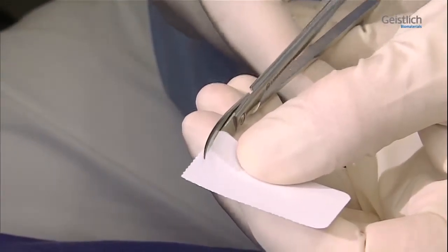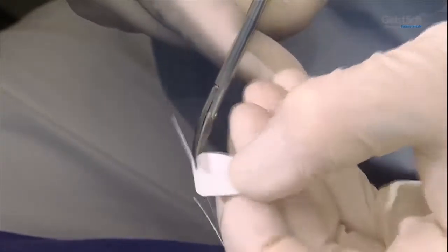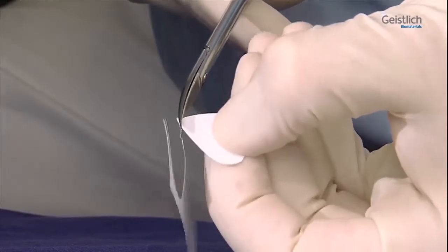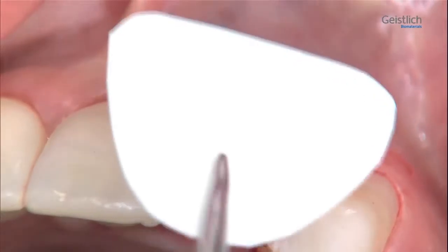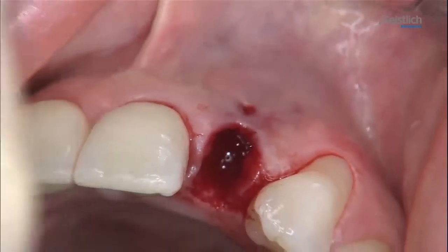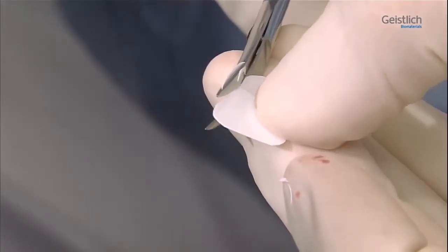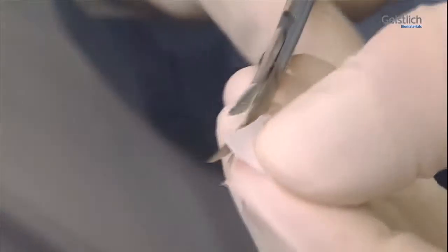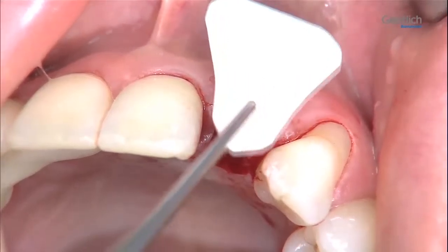We then cut a template for the membrane from a sterile sheet of paper. The sterile template is best cut with curved scissors. To check the shape and size match, the template is held against the outer side of the defect. In a further step, the contours of the template are refined. The membrane must overlap the defect region both mesially and distally. It should rest on the adjacent bony structures and ensure a good crestal seal of the socket.